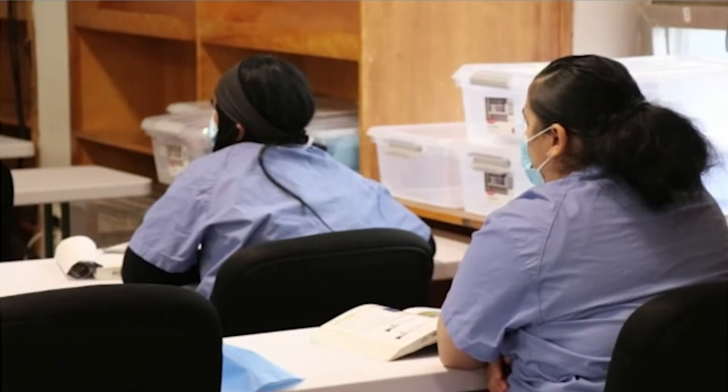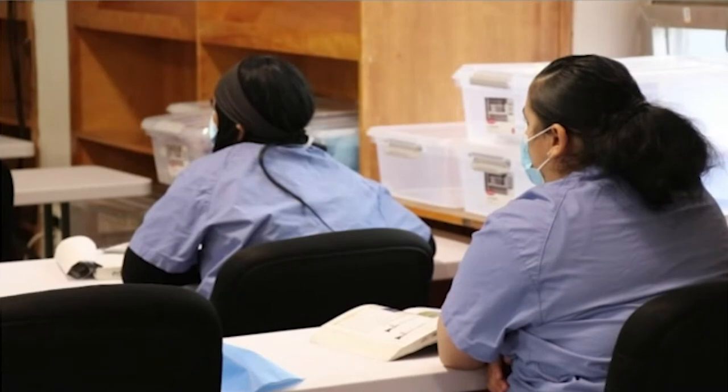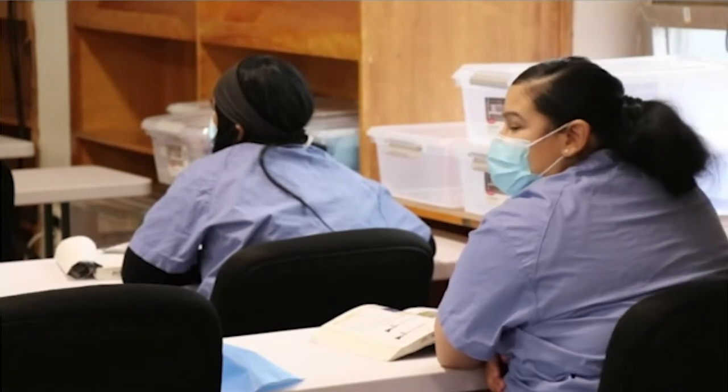This is the paper that we just saw. It's medical grade, it's approved. And what it does, you want your trays to be neat and orderly. So certain things, if you have a tray that has a lot of forceps in them, your needles, you can put them all in there. As long as you're accurate, when they get it to the field, they'll put them in there and they'll be thankful that you guys made the trays look nice and neat.